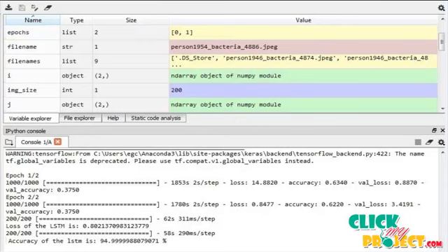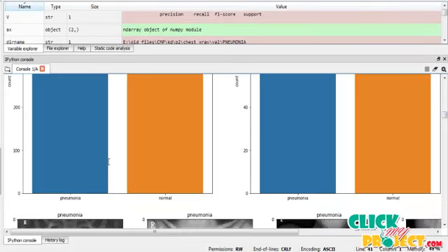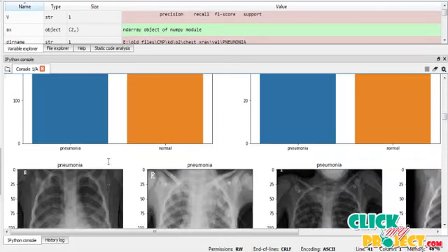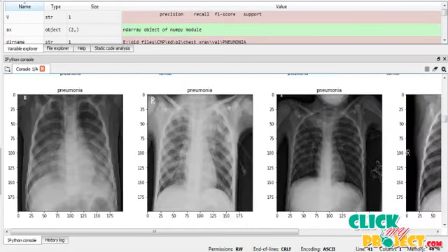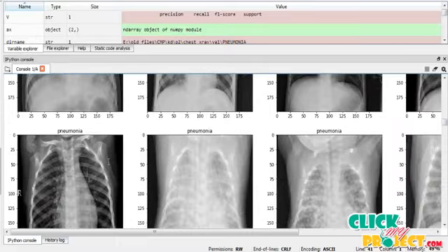This is the output of our program. The accuracy of LSTM is 94%. The plot was drawn comparing pneumonia versus normal patients. These are the grayscale images of pneumonia patients.